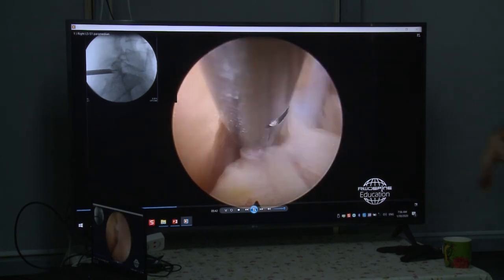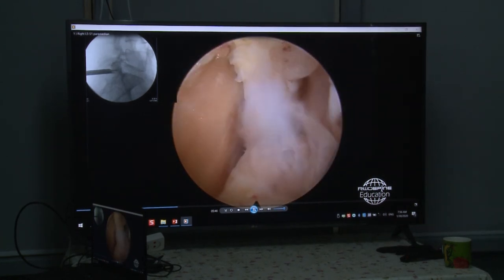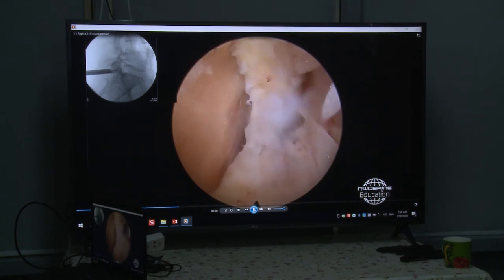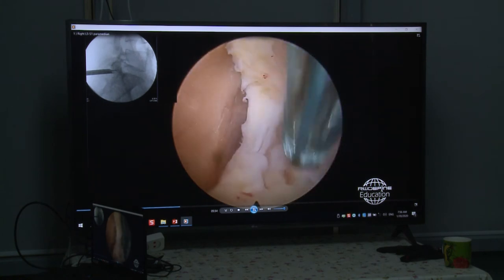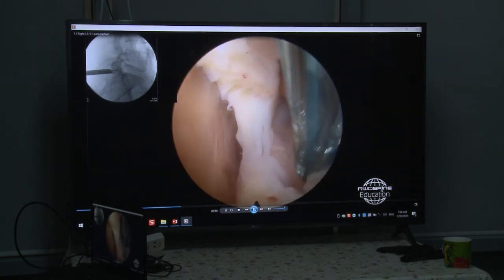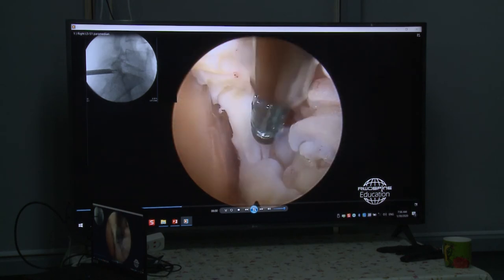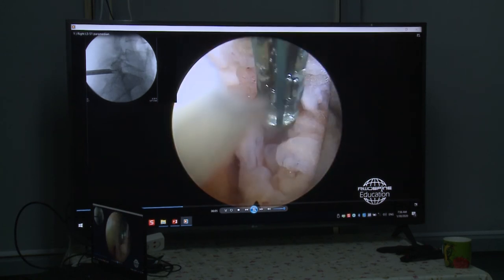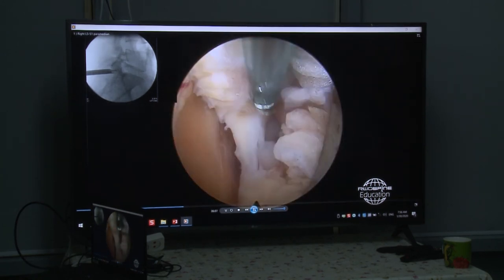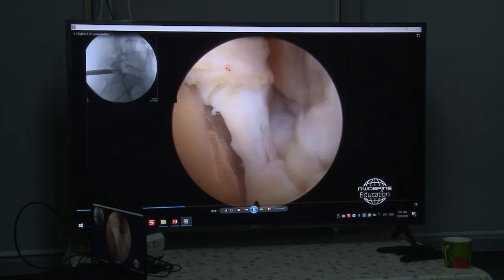Right side, the cranial side, caudal side, medial. That here is the joint. So here you see the joint. That's the ascending facet, the medial margin of the ascending facet, where the deep layer of the flavum ligament inserts, and here the descending facet. Okay, here the joint.